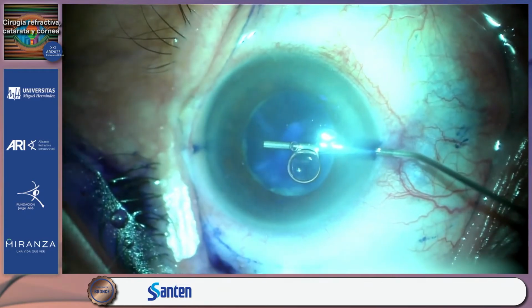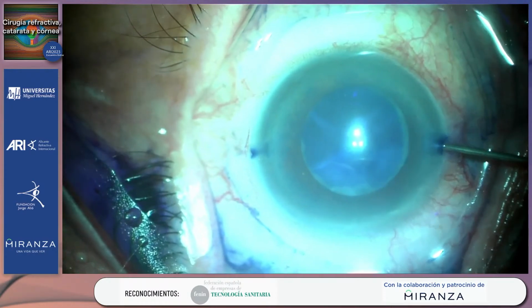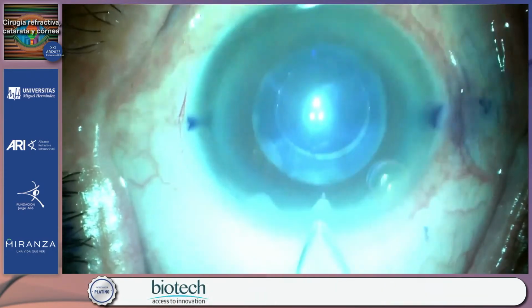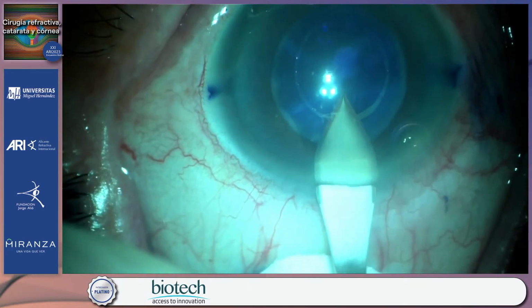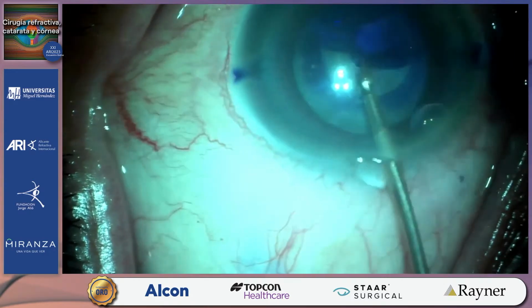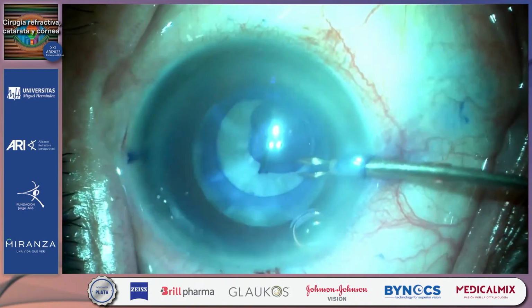The anterior chamber is slowly stabilized with Capsuvisc, a special OVD. After aiming, the anterior capsulotomy is shot with a Capsulaser. As you can see, the diameter was adjusted on the fly to the stained area. A Koch forceps is used to remove the capsule disc.